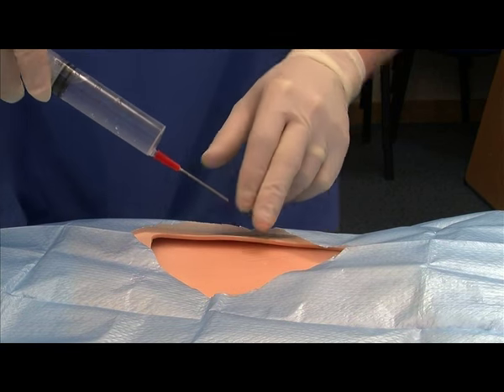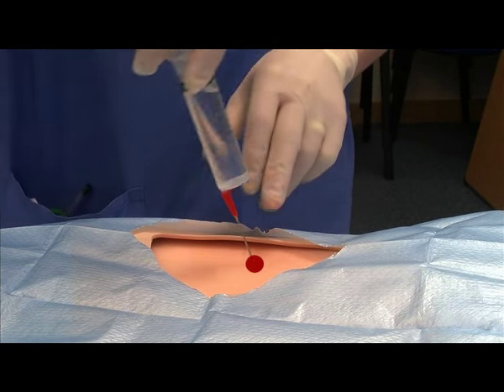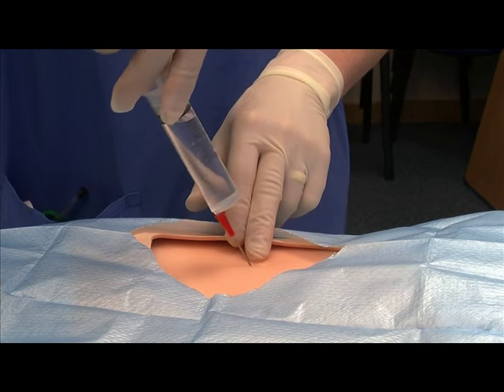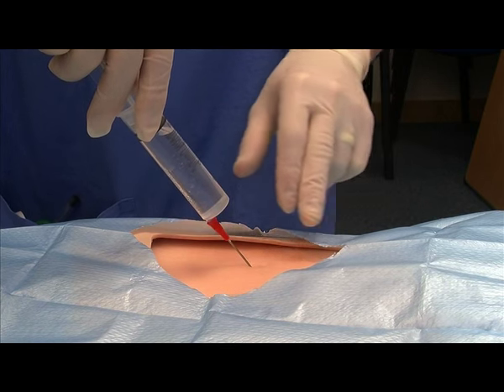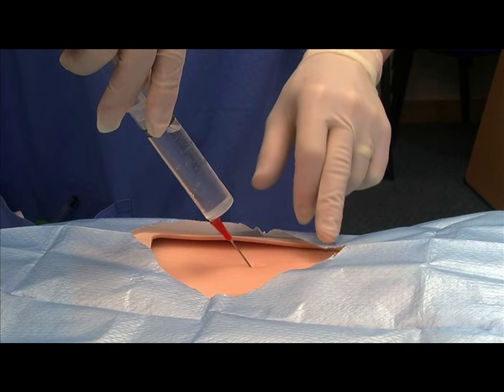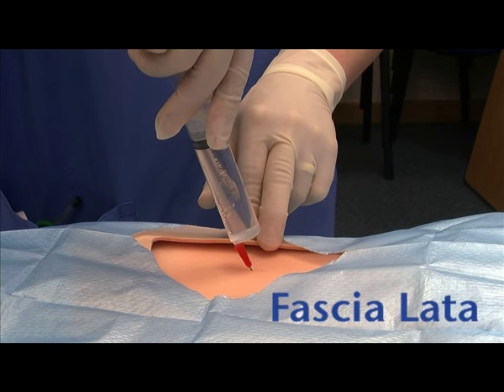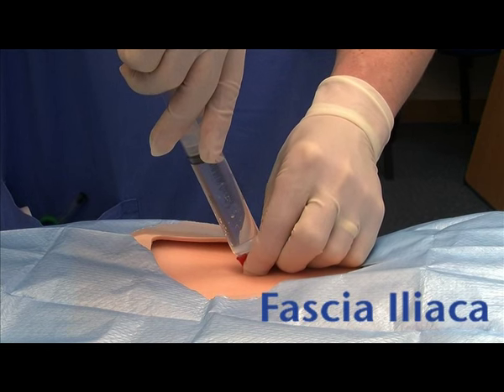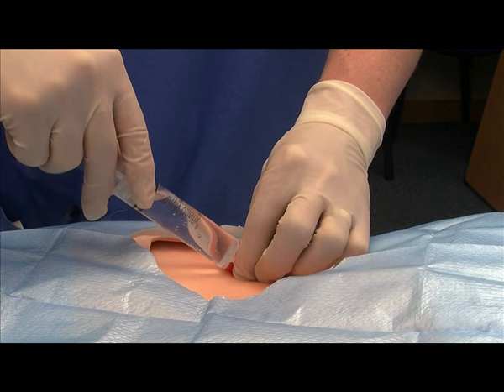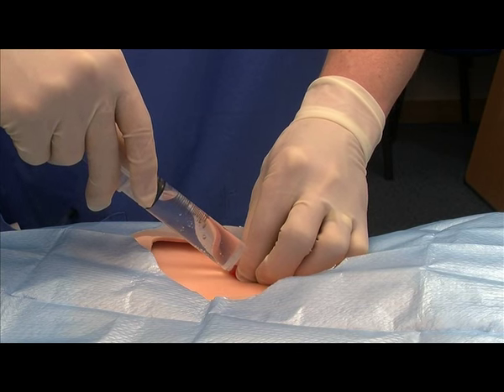Using an 18g blunt fill needle and one of the prepared 20ml syringes, pierce the skin at a right angle to its surface. Once through the skin, adjust the needle angle to about 70 degrees, directing the tip cranially towards the ipsilateral shoulder. Keep the needle in the sagittal plane to avoid the major vessels medially and peritoneal cavity cranially. Advance the needle through two distinct pops as it perforates first the fascia lata and then the fascia iliaca, the latter of which gives a more subtle pop. Then reduce the angle between the needle and the skin surface to about 30 degrees and advance the needle a further 1 to 2mm.